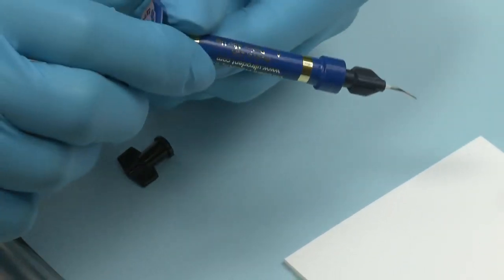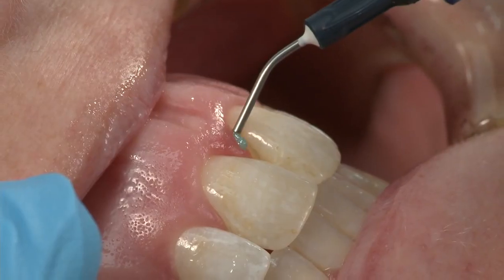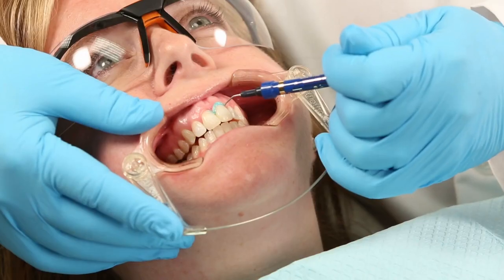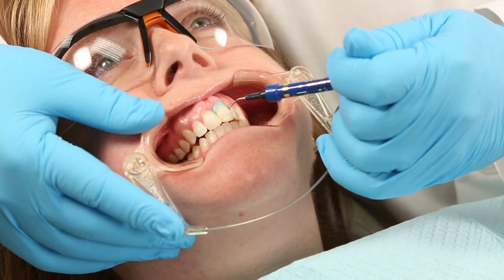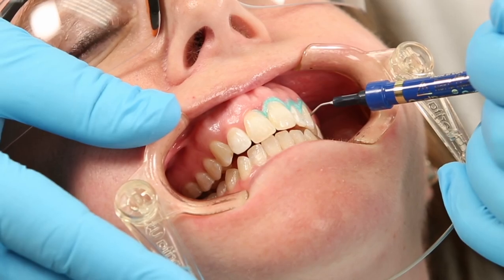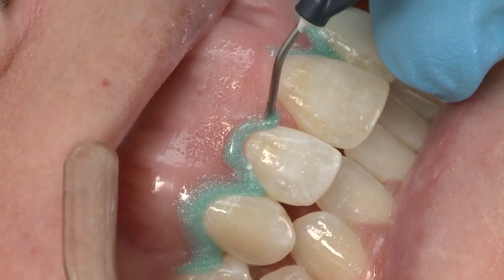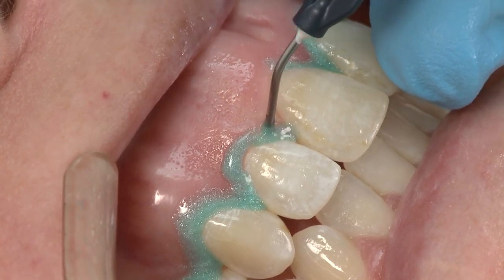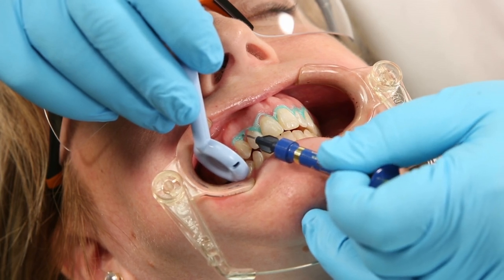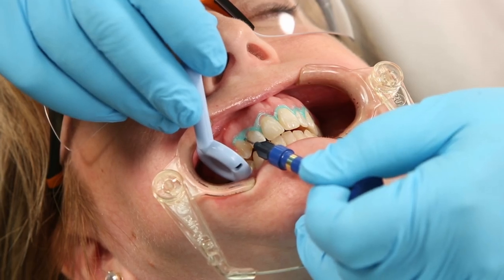Alternatively, a light-cured resin barrier such as Opal Dam can also be placed at the gingival margin prior to the procedure to prevent tissue damage. When using Opal Dam, express the resin to build a 2 mm strip along the gingival margins extending about 0.5 mm onto the enamel. Extend the resin beyond the last tooth to be treated. Where open embrasures exist, express resin through the opening onto the lingual gingival tissue. This will protect interdental papilla and lingual gingival tissue, as well as add retention to the Opal Dam.